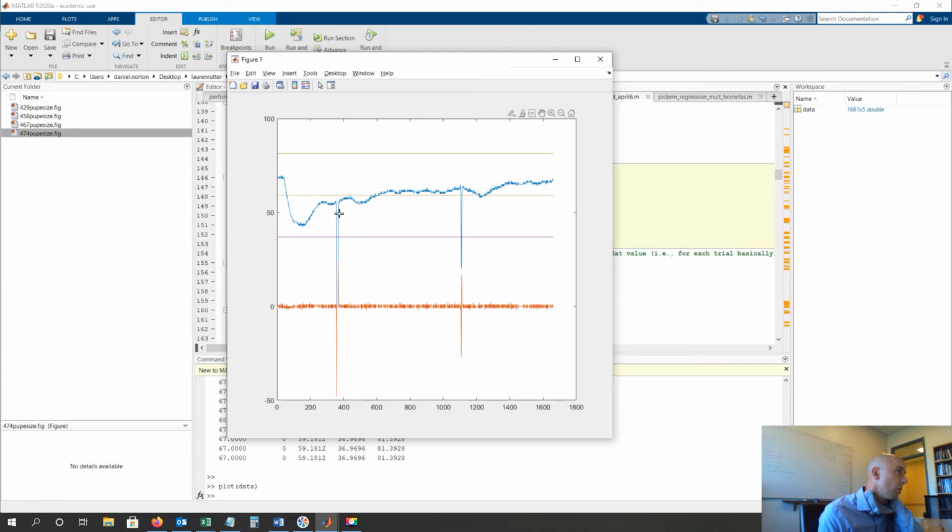But there are some other frames where it persists at 0 for a few frames in a row, where the velocity is again 0. See that teeny point right there in between this spike and this spike, where the velocity is still 0? If we just based our filtering on velocity, we would include that frame of a 0 pupil size, and we would not want that.